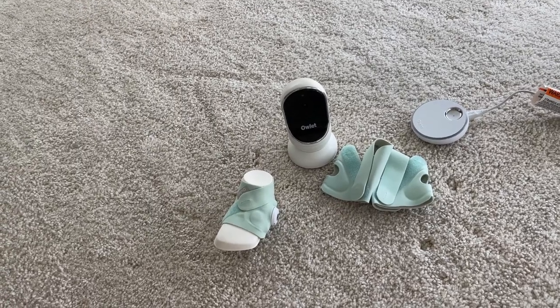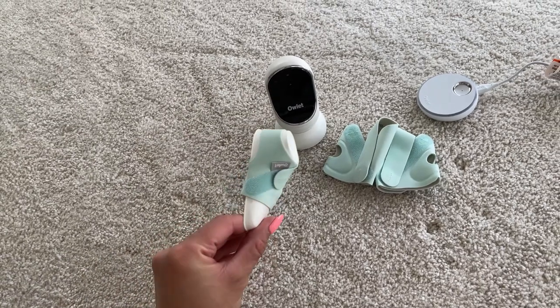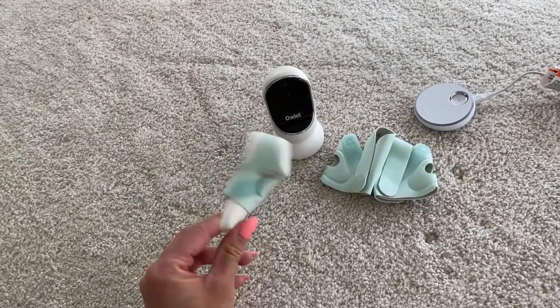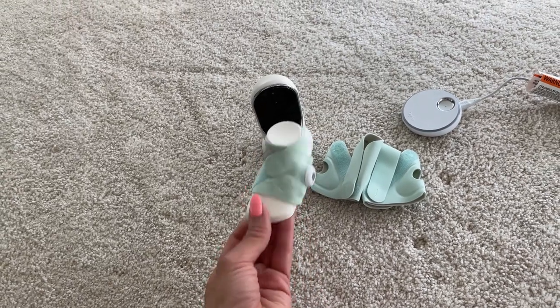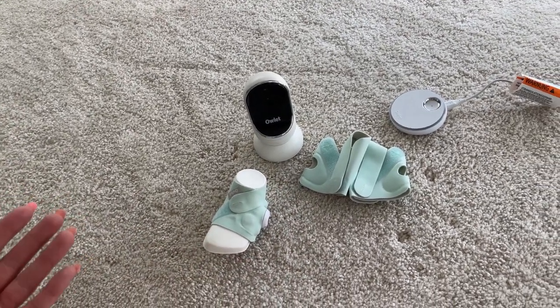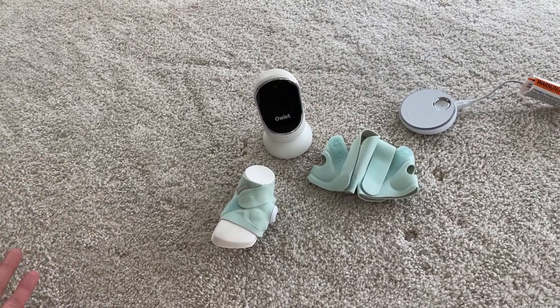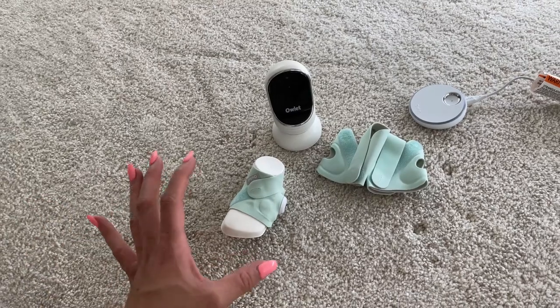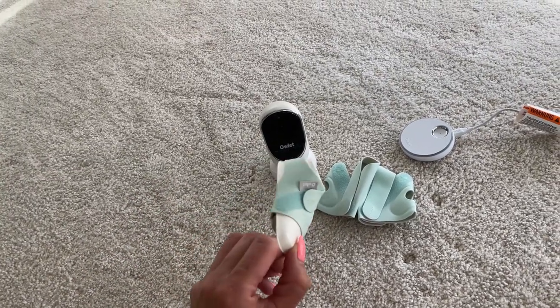Hey guys, today I'm going to do a quick review about this outlet camera and this dream sock that we got for our baby. I still have the little foot so I put it right here so you can see it better. We had this for a while now and I just thought it would be cool to make a review and talk about it and my experience with the product.